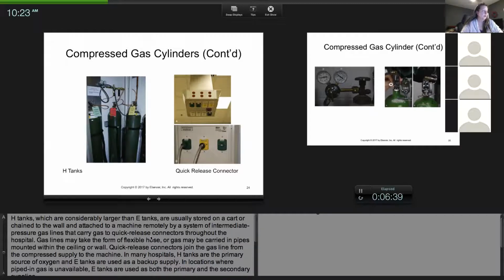Now, these hoses in the ceiling, so this would be like in the ceiling, and you'd look for the green hose. You would hook up the anesthesia machine, you would pop it in the green hose, and then it would draw from these tanks. So usually in our hospital, these tanks were always on because we were a 24-hour emergency hospital. So you needed oxygen at a moment's notice.